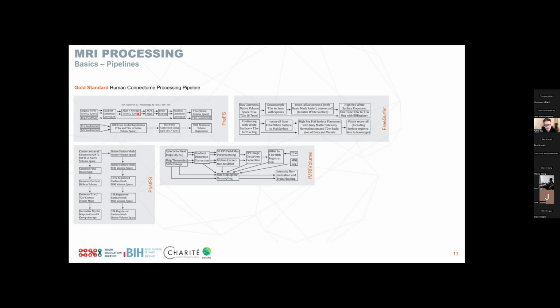So we want to align them, multiple registration steps, and then we have an ACPC alignment. So we have those long anatomical landmarks in the brain that we want to align to. So there's a lot of steps that actually make up a single step of such a volume. Those 4 are just selected because those are the ones that we're going to keep for our actual stroke pipeline, but we don't need to go into too many different details here.